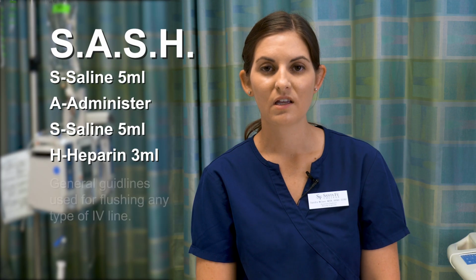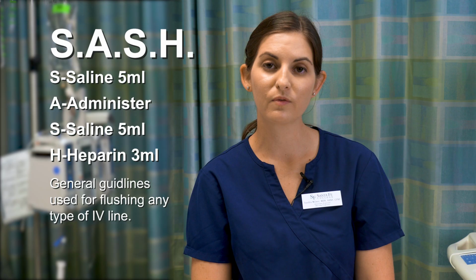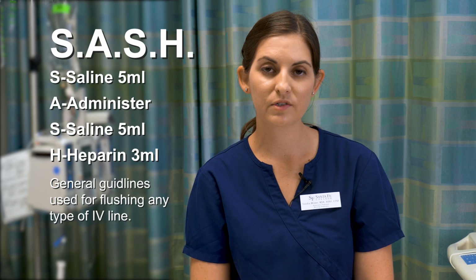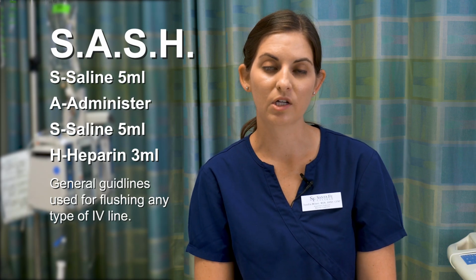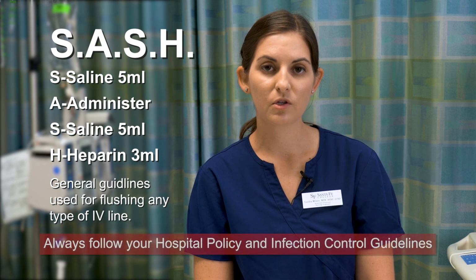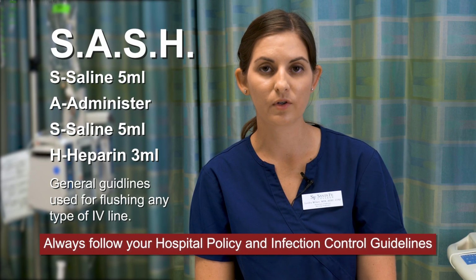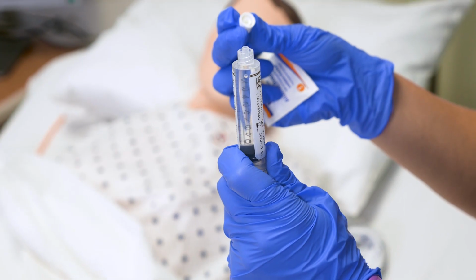At Santa Fe Nursing Labs, we use an acronym called SASH, which stands for Saline, Administer, Saline, and then Heparin. These are general guidelines that are used for flushing any type of IV line, either a peripheral or central line. The amount of fluid that we use falls into the majority of the evidence-based guidelines for flushing. Depending on the hospital you go to, you want to make sure that you follow their policies for flushing peripheral and central lines. I'm going to get the air out of my normal saline flush syringe.